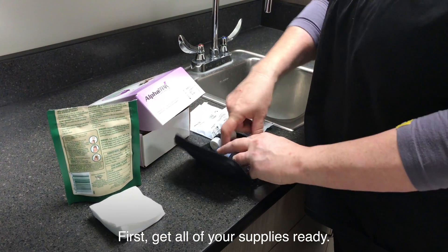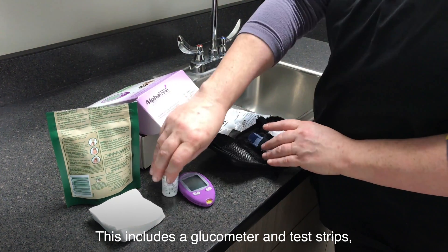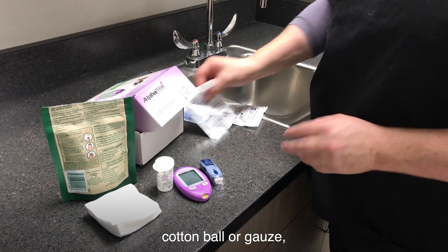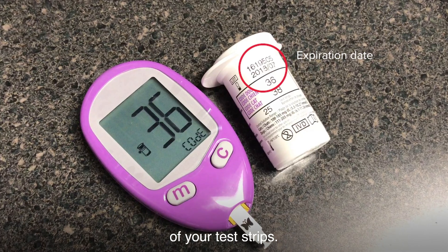First, get all of your supplies ready. This includes a glucometer and test strips, needle or lancing device, cotton ball or gauze, and diabetic-friendly treats. Be sure to check the expiration date of your test strips.